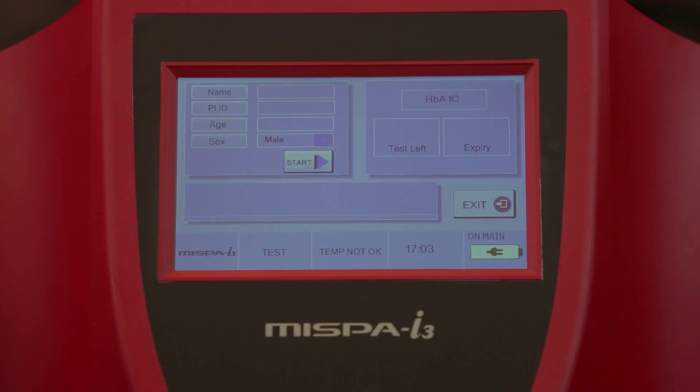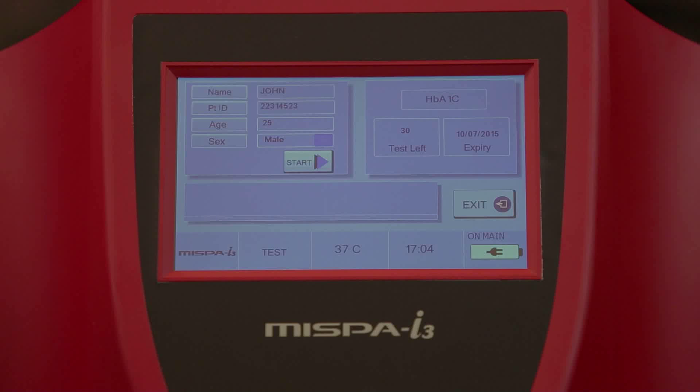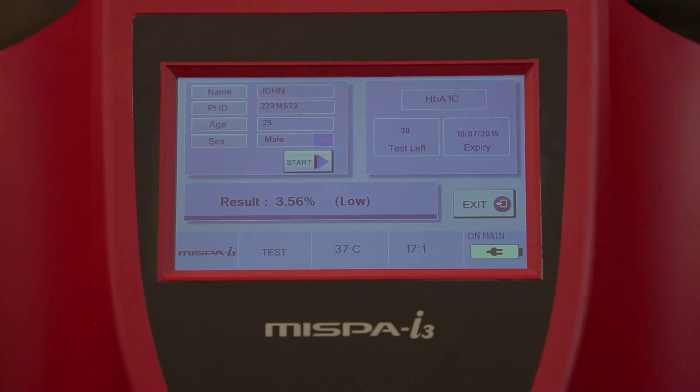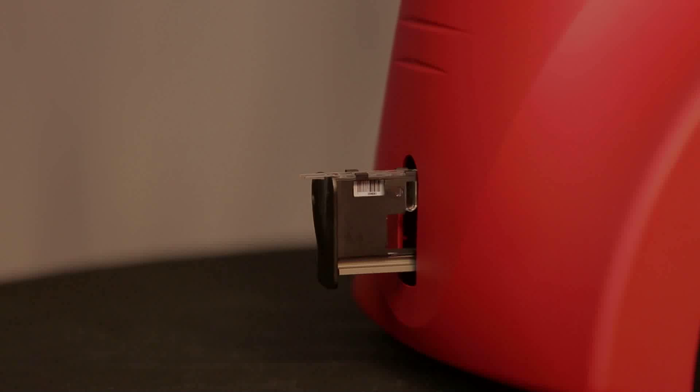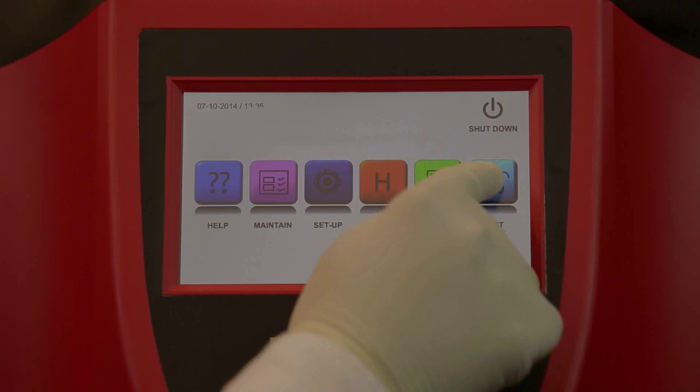Select OK to proceed. Enter patient demographic data and select Start to run the test. Status updates along with a progress bar will be displayed on the screen. Once the measurement is completed, the calculated result will be printed and displayed on the screen. The carriage comes out with the used cartridge. Remove the cartridge and select Continue to proceed for the next test.